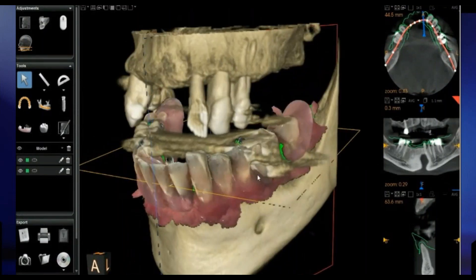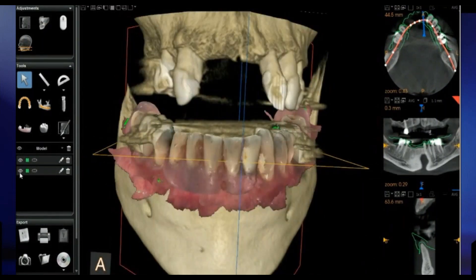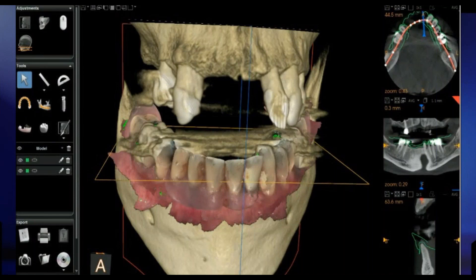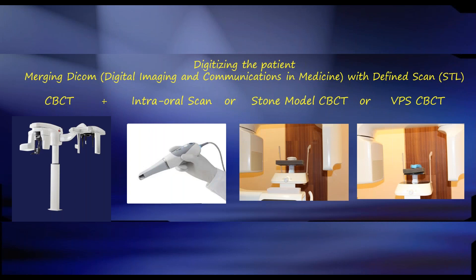In this case, we did two optical scans — one of the patient with edentulous areas and one of the patient's prosthesis. You can align both images with the CBCT, and it does the automatic alignment. This is real-time video, not sped up at all, showing you can actually do this in a consultation room with the patient there. You can see the two images aligned in the lower right — edentulous and prosthetic. You can use this to show a patient why they need bone grafting or why you might want to change a treatment plan.